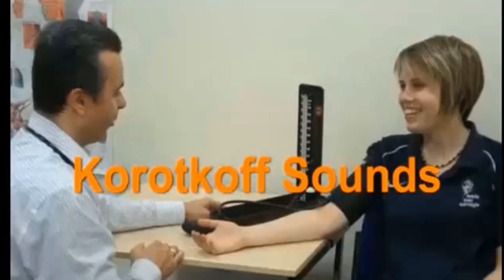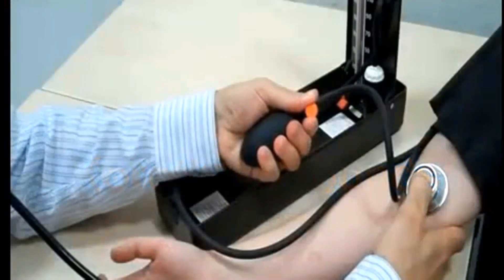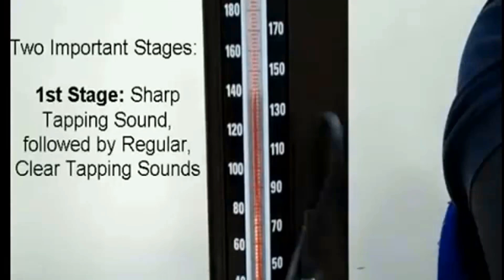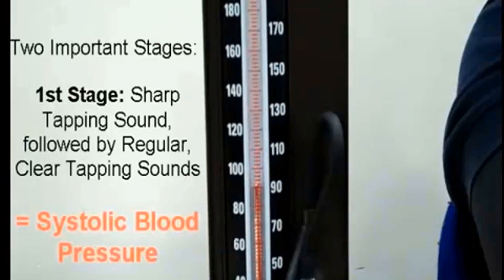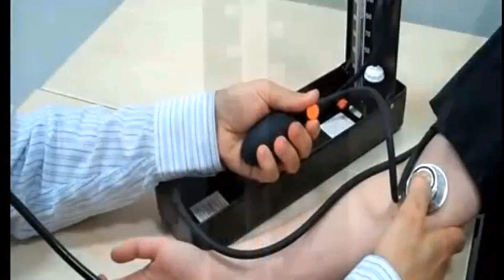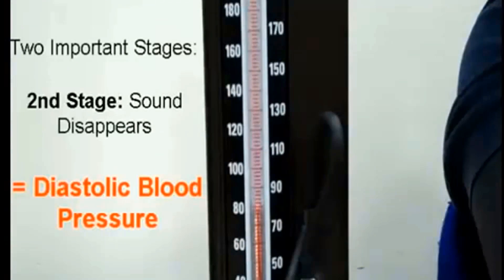Anything faster may likely result in an inaccurate measurement. Continue to listen as the blood pressure cuff pressure drops and the sound fades. When you hear a sharp tapping sound followed by regular clear tapping sounds, that is called systolic blood pressure. When the sound disappears, note the reading, which is called diastolic blood pressure.